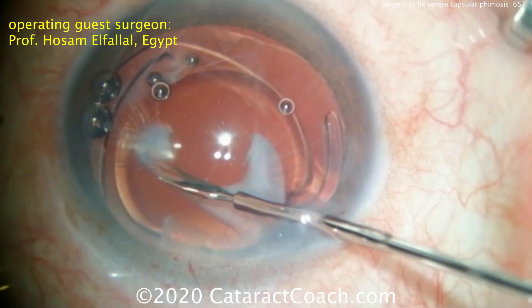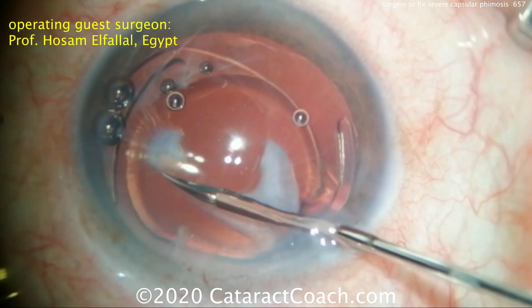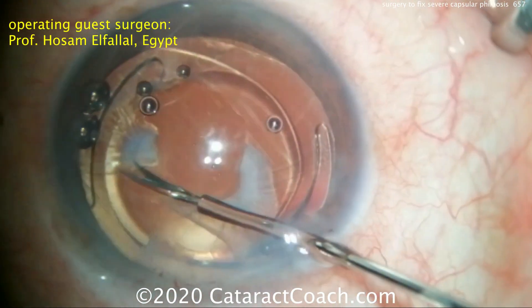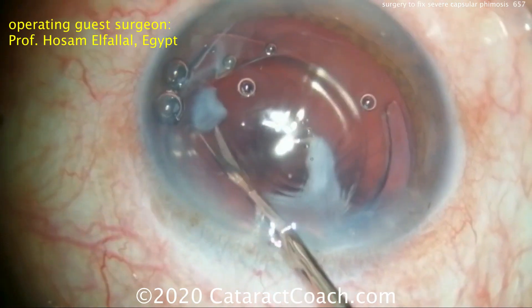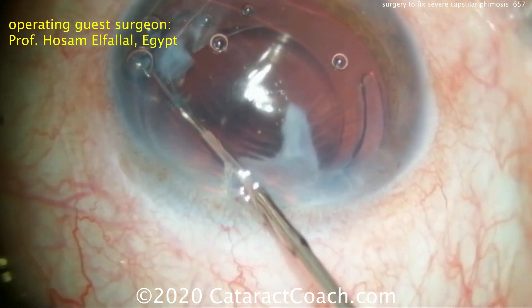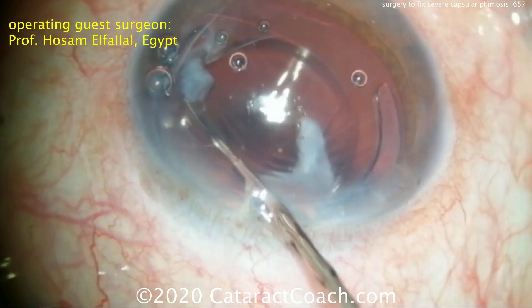A few more cuts are made here with the micro scissors. This is a process that takes a little bit of time and stick-to-itiveness, but then you can achieve a nice outcome. The base is cut off and the piece can be pulled out of the eye — that looks pretty good.